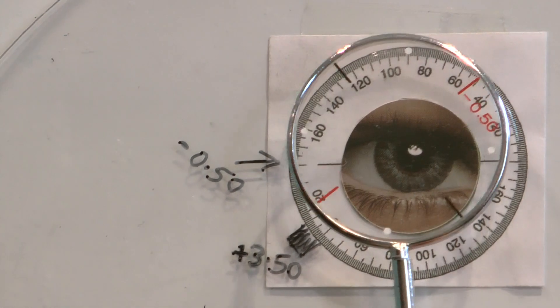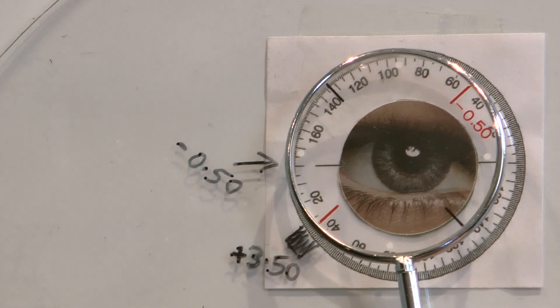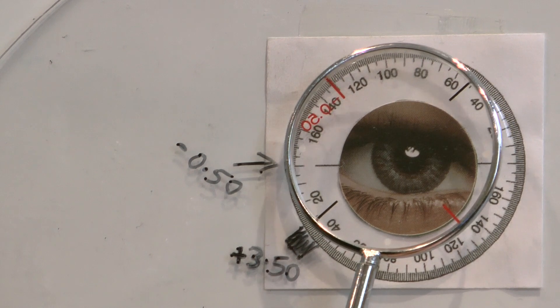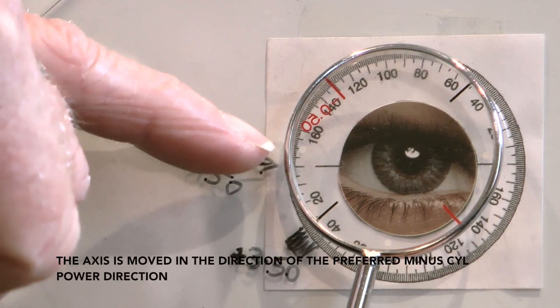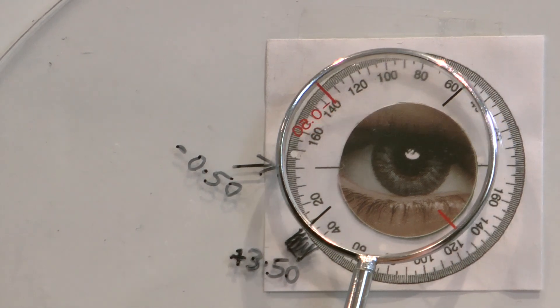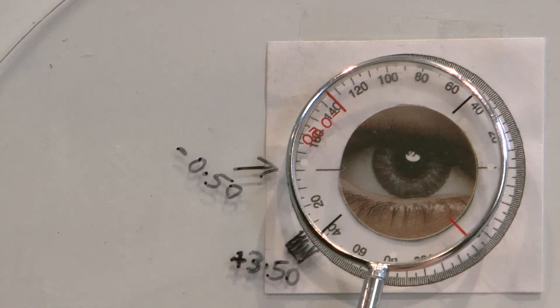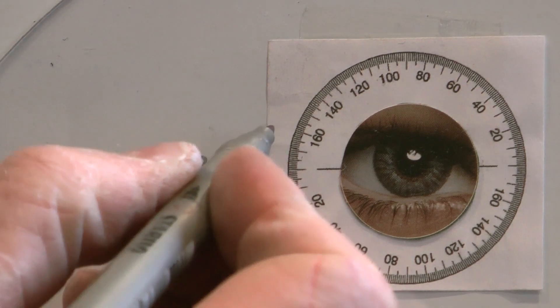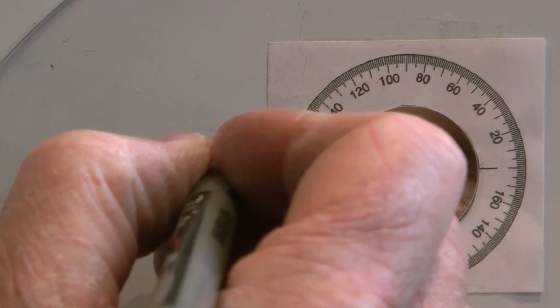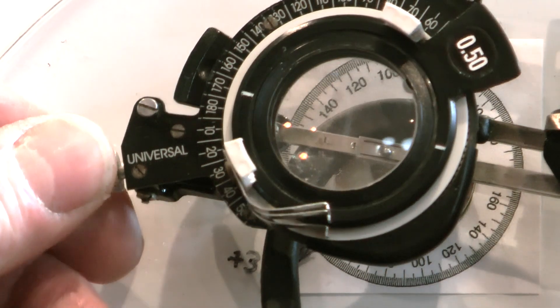We're now asking the patient to compare those two positions. Do the circles look more round, clearer and sharper in position one or position two? If they say position two, then we need to move the cylinder power in that direction, towards where the minus 0.50 is running. We don't move it a huge amount — just in small amounts because we're slowly getting to the right direction. We move the cylinder axis by ten degrees, so we rotate the cylinder in the trial frame so that it is now at the 170 meridian.